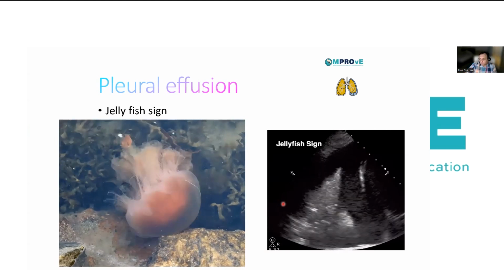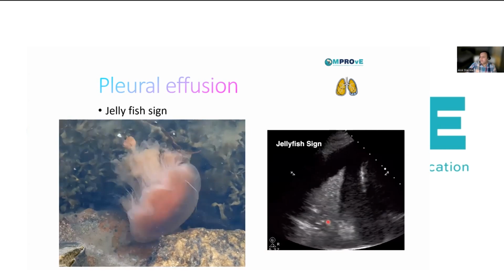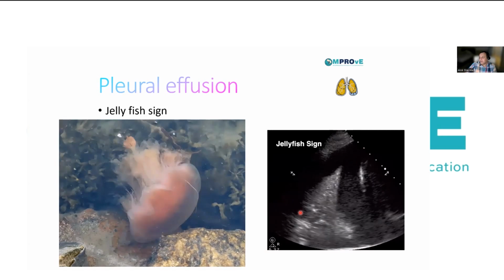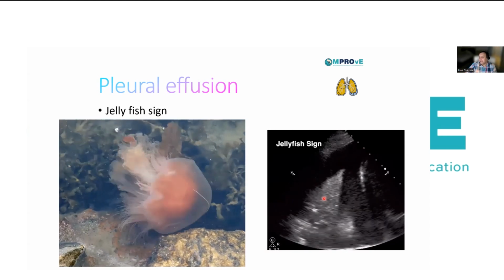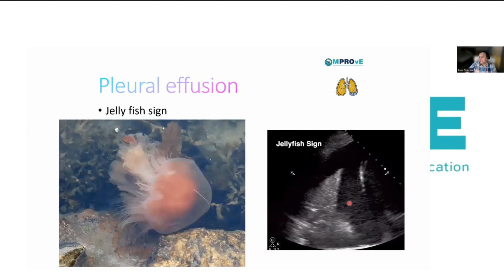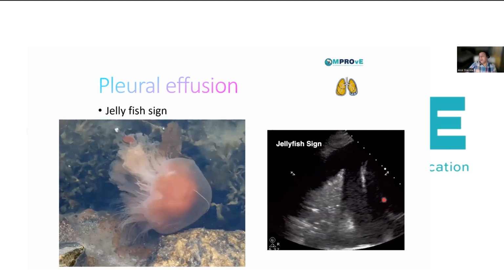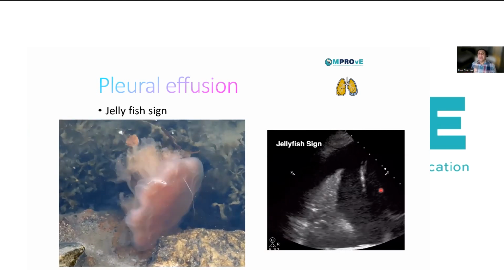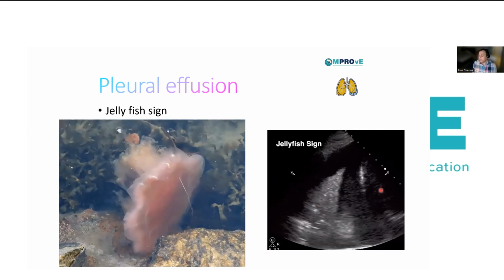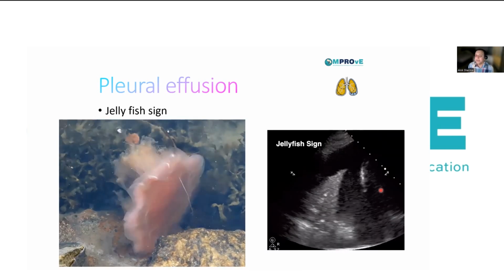Now, for those of you who do lung ultrasound, what you can also see in this image is static air bronchograms, which again fit with atelectasis. But if you start seeing dynamic air bronchograms, and with the eye of faith I can see one area of what I call a dynamic air bronchogram, where the bronchogram is disappearing and appearing, that says to me this could be a pneumonic consolidation. So what I'm highlighting to you is not just that you can diagnose a pleural effusion, but you can get an idea of the underlying lung condition and lung disease.